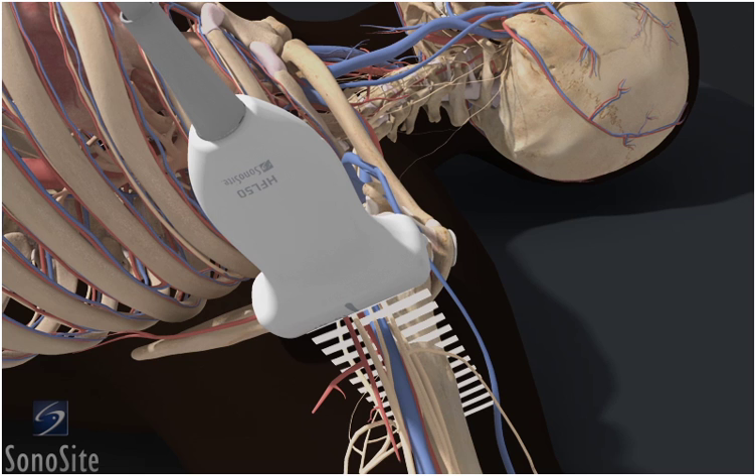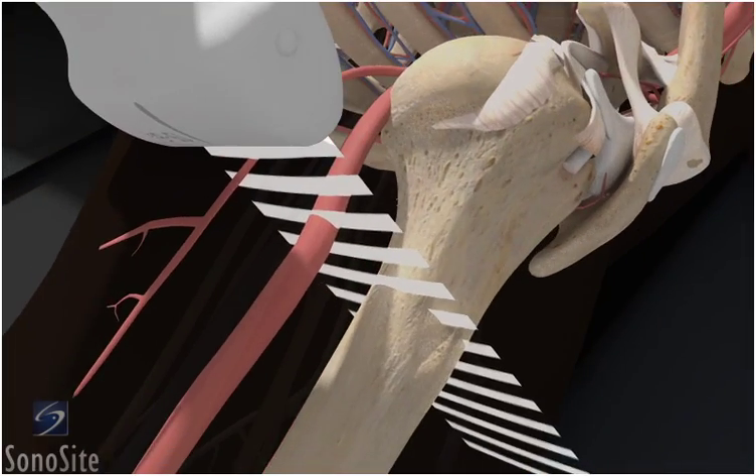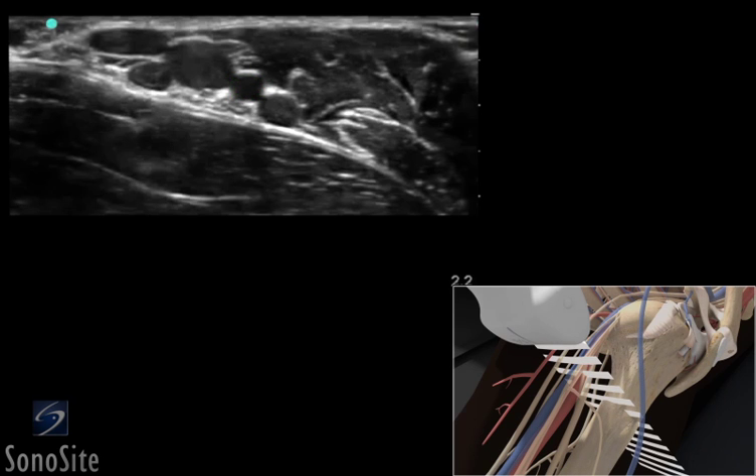Slowly slide the transducer in a lateral to medial direction to identify the axillary artery. The axillary artery is a dark, round, pulsatile structure with a hyperechoic wall.